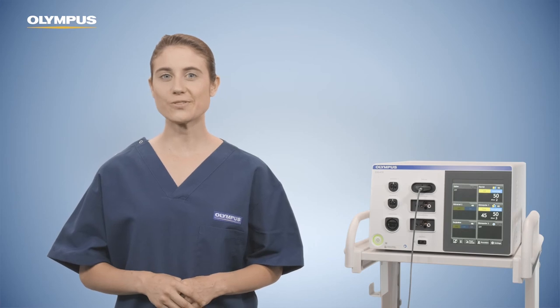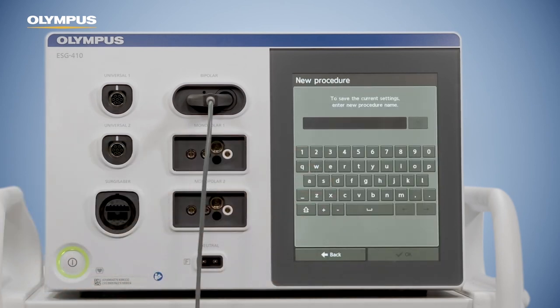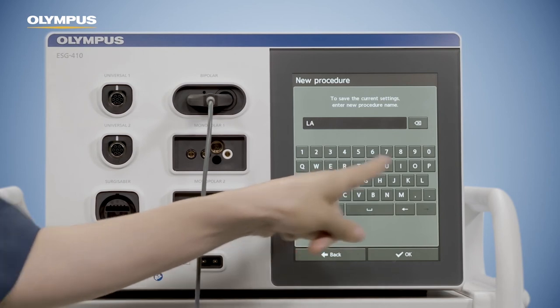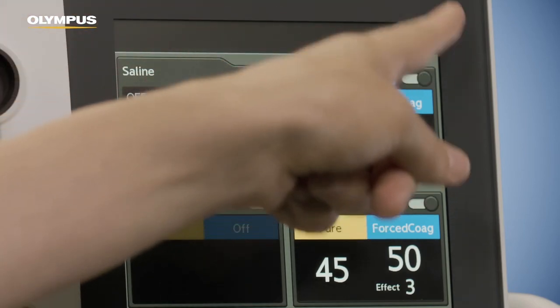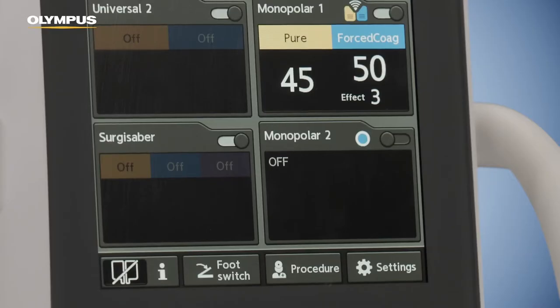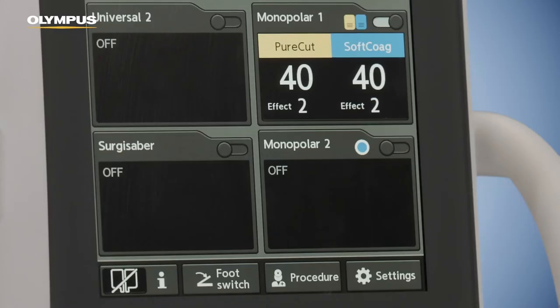Current settings can be saved as a user-defined procedure. Tap the procedure button and click save, then choose a name for your procedure and confirm with OK. This procedure name will be shown on the home screen when selected. The saved procedure captures selected modes, power and effect levels, footswitch assignments, as well as auto-start and baby neutral electrode settings. This helps you quickly recall settings for a specific procedure. You can also select a previously saved user-defined procedure from the list in the procedure screen. User-defined procedures can be stored to a portable USB flash drive.